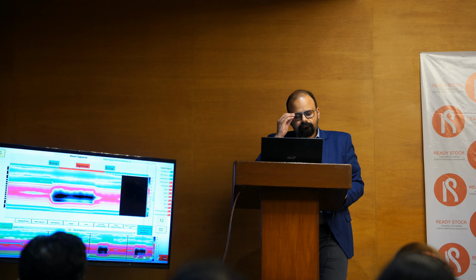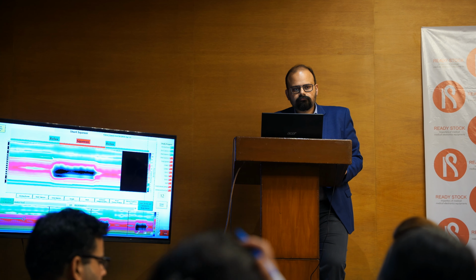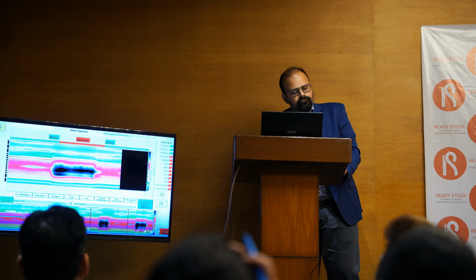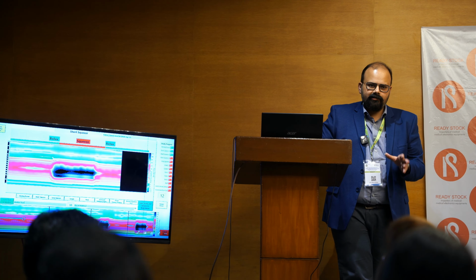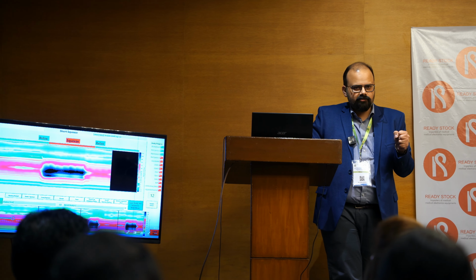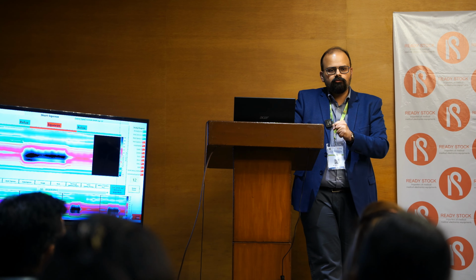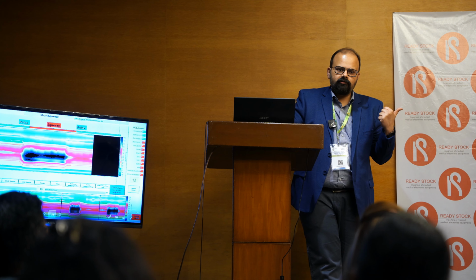Question. The London protocol says that you have to wait for 30 seconds. Is it that important when it looks so normal? See, if it's very normal, you can do it back to back. Ideally, yes. Why? Because when you have squeezed once, it will take at least that much time for the tone to go back to normal for the next squeeze to come. Same when you do it for esophageal.